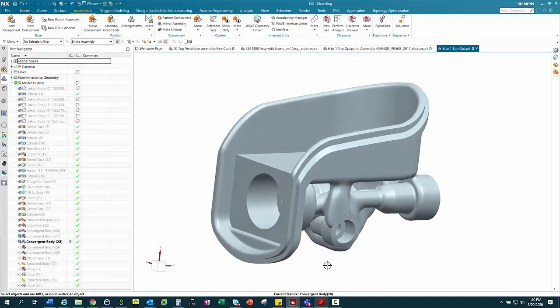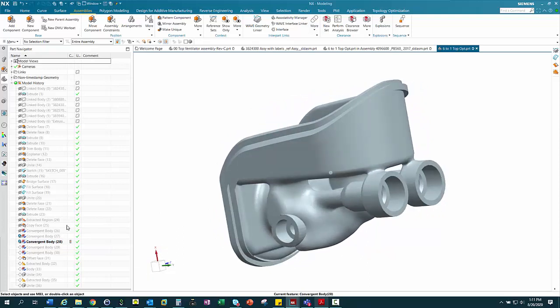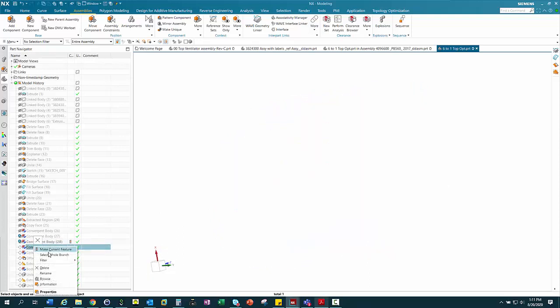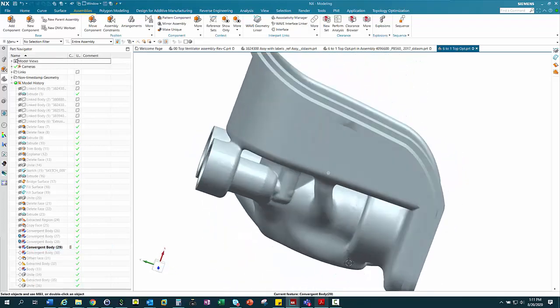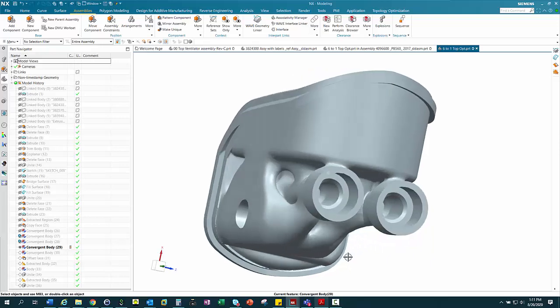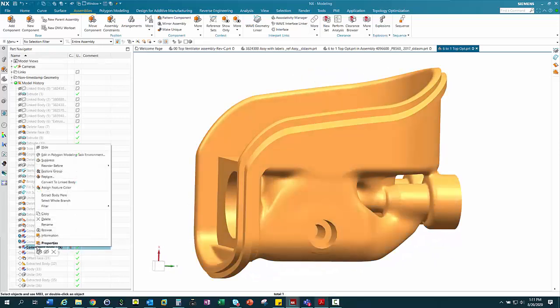And because we're printing it in plastic, we don't have to worry about supports with the multi-jet fusion, because it prints it in the powder that it actually makes the part in, so it builds its own supports. And you could nest many of them at the same time. And just to show you a couple more examples. So here's another example. But what's nice about this is you can make many, many different examples.